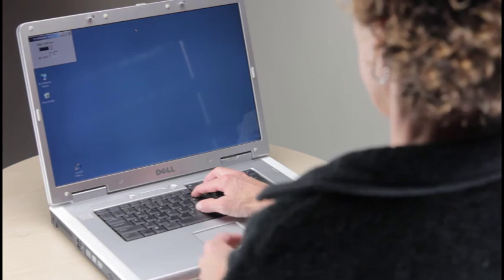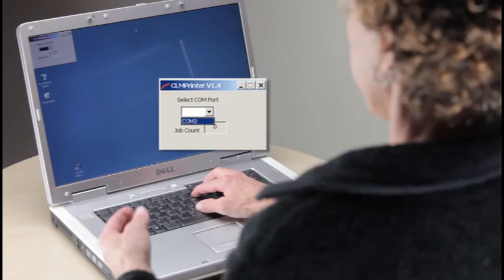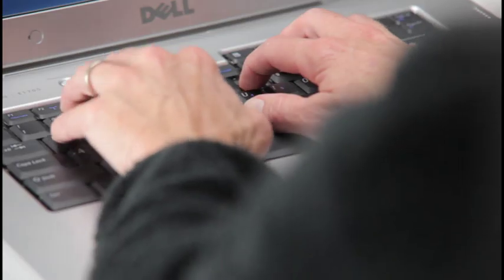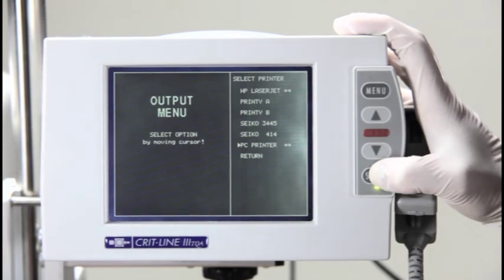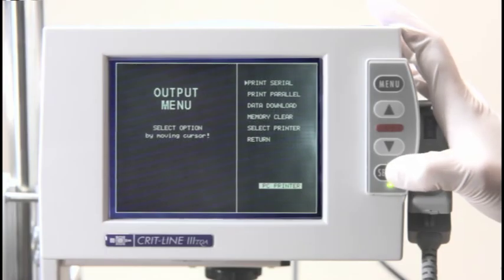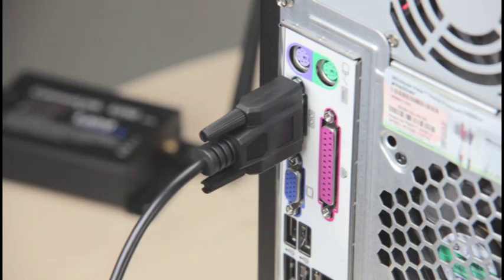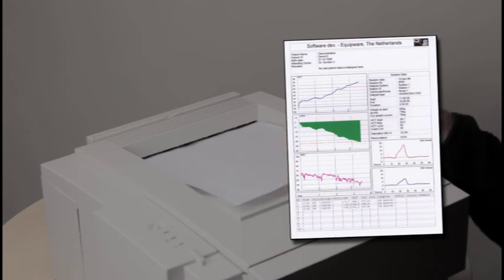Once you load the printer software, simply choose the communication port to which the server radio is connected and you are ready to print. Make sure this software is always open when you want to print — it works in the background, allowing you to use your computer for other tasks. Before you print, make sure you see both a green light and a red light on the client radio, which means the client radio and the server radio recognize each other. To print a treatment profile, make sure the PC printer is chosen as the default printer and then select print serial. Once you select print serial, the treatment profile is sent wirelessly to the server radio and then the software will send a command to the printer to print the treatment profile. With wireless printing, you only get a hard copy printout — no data is stored electronically.